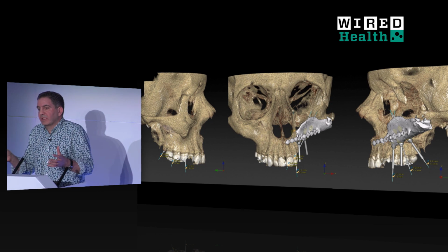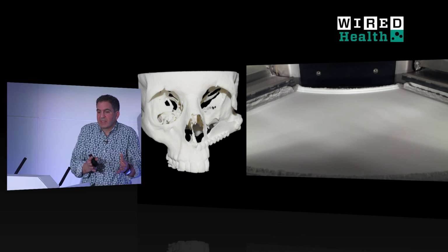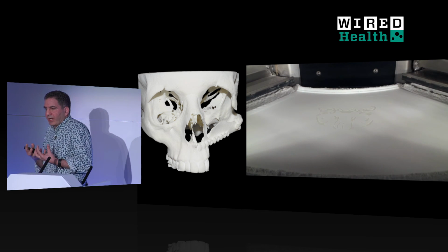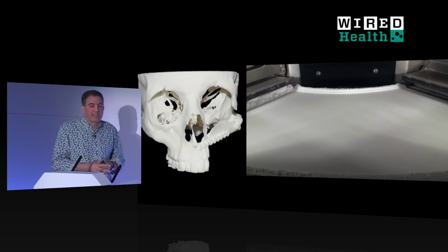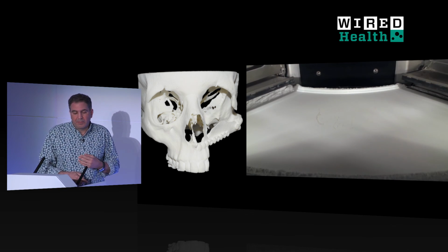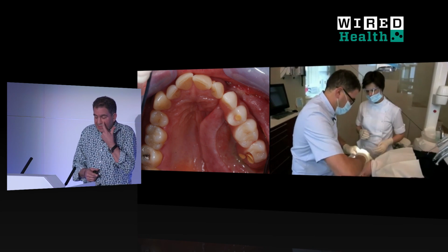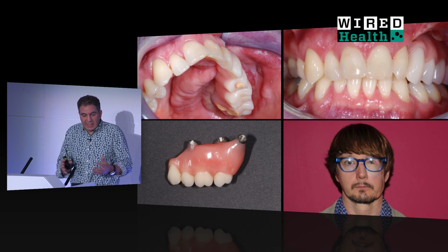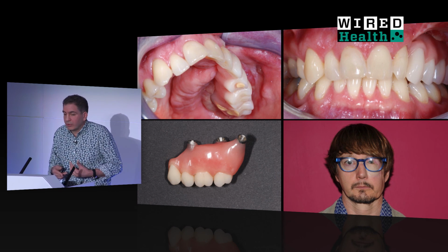And how do we go about this sort of treatment? Well, by 3D printing the skull, by 3D printing the problem, it's so much easier to find a solution, to tangibly hold in our hands an object that we can get so much information from before we go into surgery. It makes surgery quicker and easier, so that we can go from a virtual plan to an actual reality quickly, less invasively, providing teeth very soon after this procedure. So this is the result that we achieved. And actually, as I hope Josh will explain to you now, perhaps this was just the start of the journey.